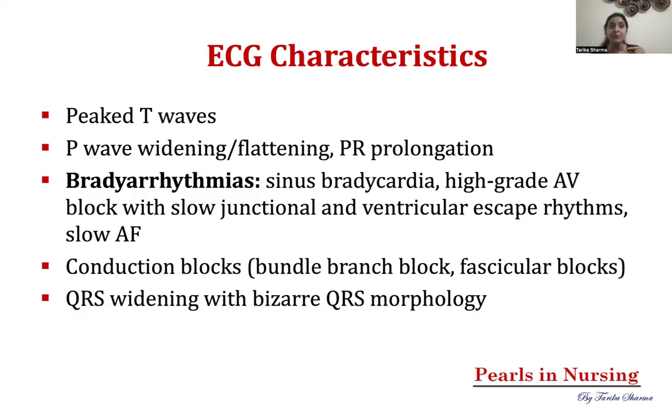हमने वहां देखा था, the person might be having a flat or inverted T wave, but in the hyperkalemia, the person might be having a peaked T wave. They can be widening of the P wave or flattening of the P wave, है ना. हाइपो में क्या था, आपके पास amplitude बढ़ जाता था P wave का, but हाइपर में क्या है, P wave widen हो जाएगा या flat हो जाएगा, and again there will be PR prolongation.